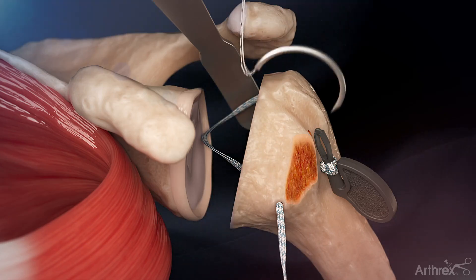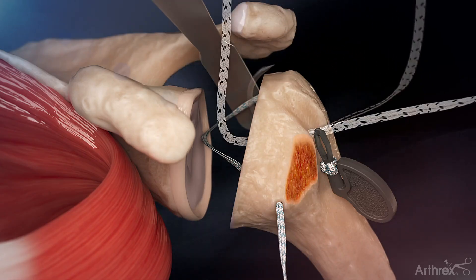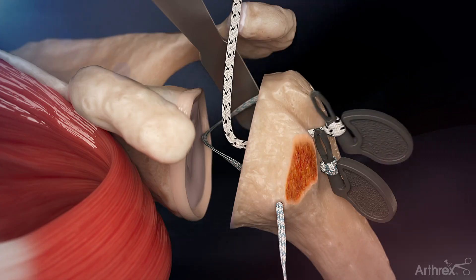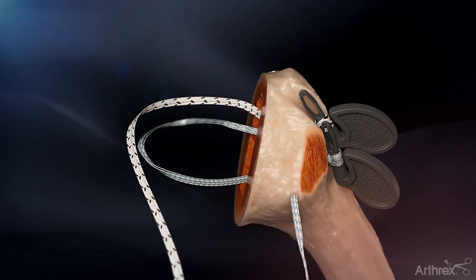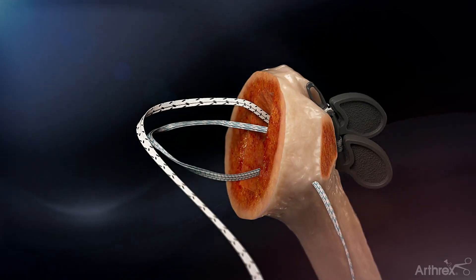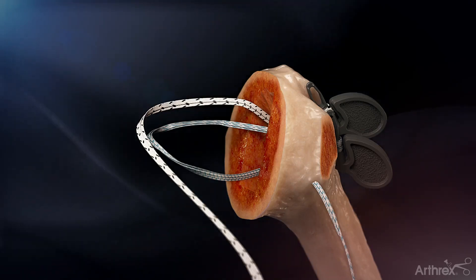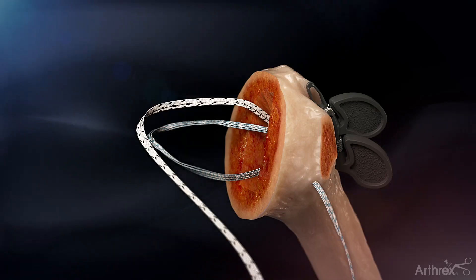Next, the tiger tape loop is removed from the card and its needle is passed through the superolateral bone tunnel. Again, the suture is unwrapped from the suture passer tab and pulled through the tunnel proximally, similar to the fiber tape strands. In this case, when a collared implant is used, there is no need to pass the tiger tape strands through the medial bone tunnel.